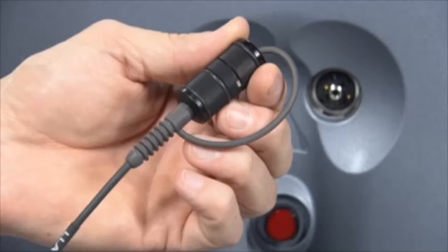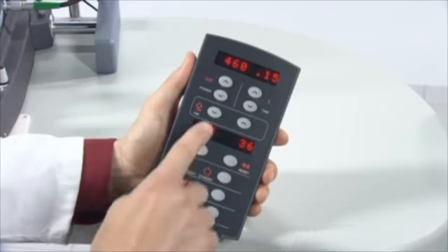Please note, do not use the delivery system if the aiming beam appears weak or not visible when set to a high intensity. This could mean that the fiber optic cable is damaged. A damaged fiber optic cable may cause accidental laser exposure or injury to the treatment room personnel or patient and could cause a fire in the treatment room.